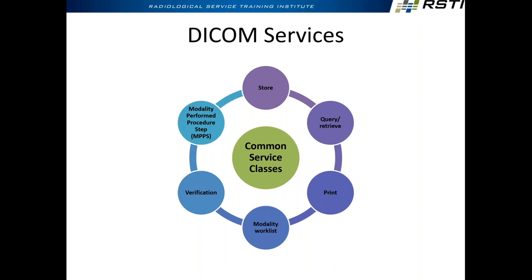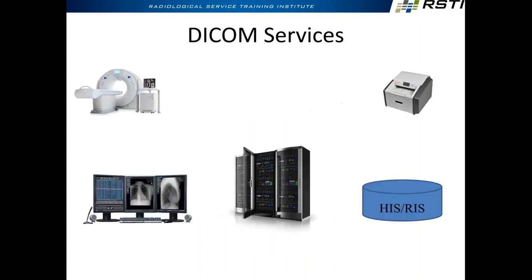I'm not going to get into MPPS, it's really too advanced for this time, but with modality performed procedure step, we'll send updates back to the RIS, for example. If the CT study gets done, it will send a message to the work list to pull John Doe's CT off the work list. So it's automatic updating, things like that on the work list. It's complicated, so let's not use it for that reason.